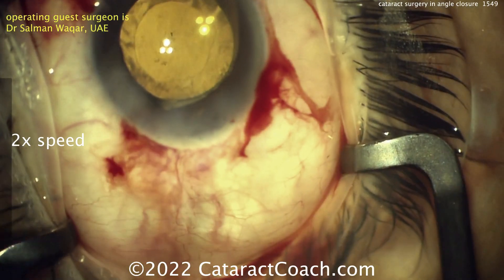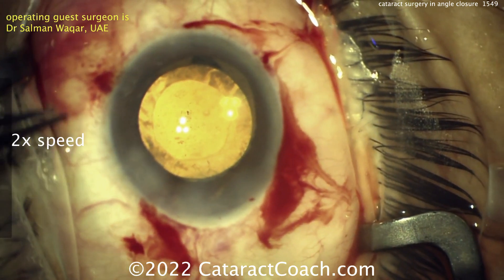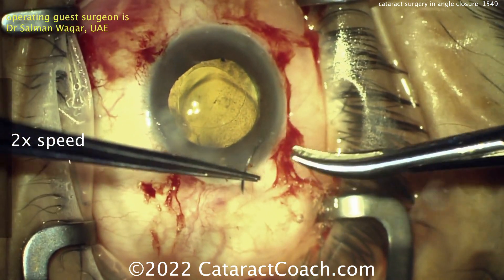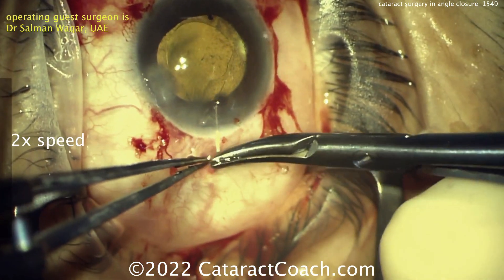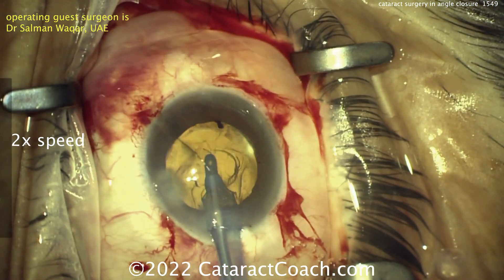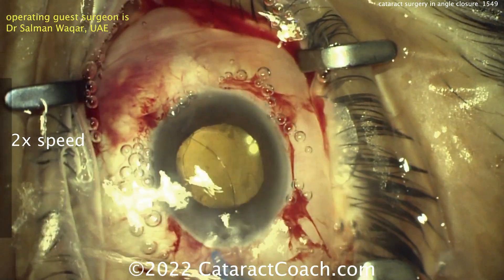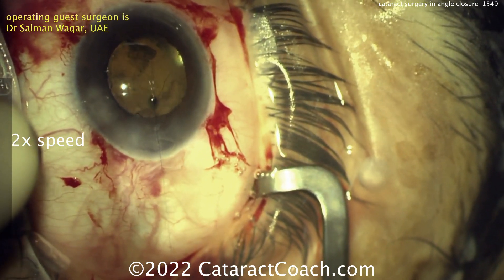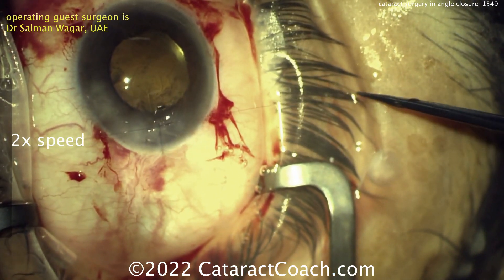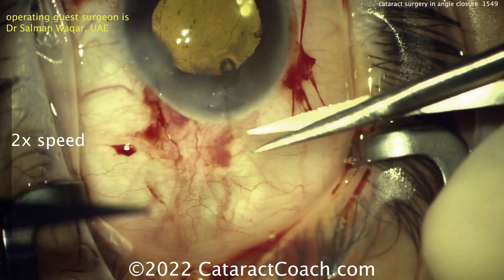You can see the 6mm optic with probably about a 4.5mm rhexis. That looks good. Taking all the hooks out — one more trick you can do here: go inside and grab the iris with your capsulorhexis forceps and pull the iris out of the angle, helping get that angle to open up a little more. You can do that for a good 360° to make sure you don't have iris still caught up in that angle. Break any peripheral synechiae you may have. At the end, I do like the idea of the 10-0 nylon — always better to be safe than sorry in this case. That's a beautiful result, and thank you for sending the video in.